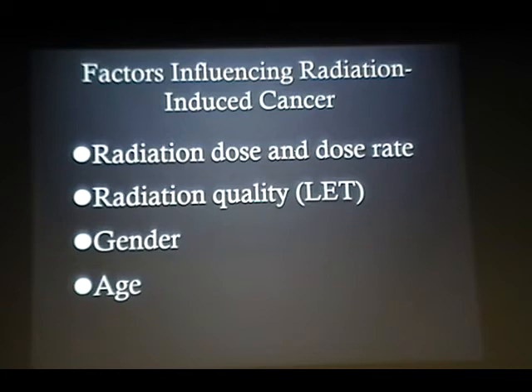The things you have to be careful about when dealing with radiation are, like, age. Generally, the younger generation is more sensitive to radiation, so you have to use appropriate protocol. For instance, in our dental radiology, you are supposed to put a thyroid collar if you are taking radiographs in children. Gender: females are generally more susceptible to radiation.